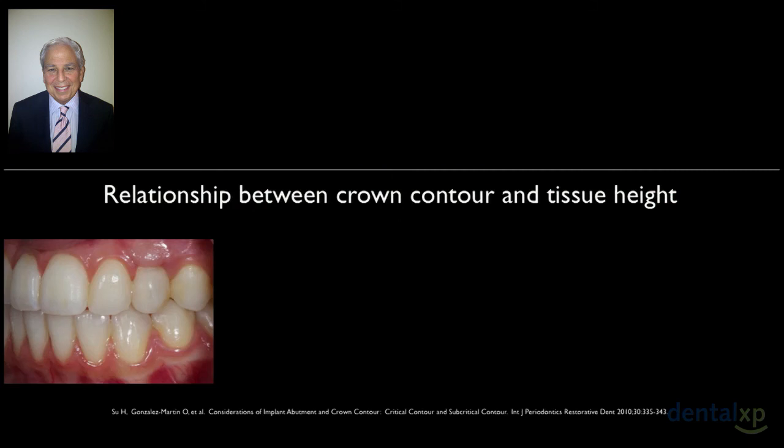And it works the opposite way too. Here's a patient of mine that came back with too much tissue. And the surgeon said to me, put on your provisional restoration, this was a delayed approach, and when the tissue heals, send the patient back to me and I will excise that tissue. I'll use a laser, a scalpel, or whatever. Well, I didn't want to do that because what if he takes off too much?